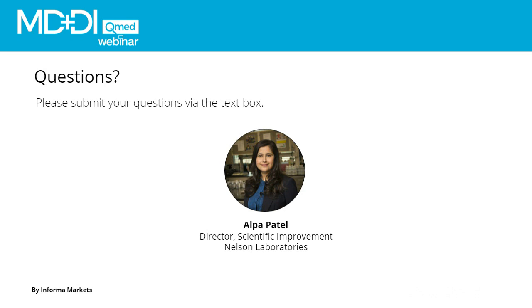Very good question. Yes, we have had many non-critical devices that are huge that we only get one sample of, but we have to perform 3 replicates of the same sample, right? So you can submit one sample for testing, and we would use that sample multiple times to get the replicates necessary for the submissions. And usually for non-critical devices, 3 has been okay to use.